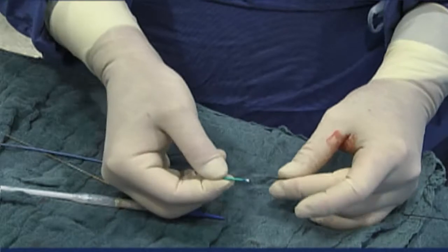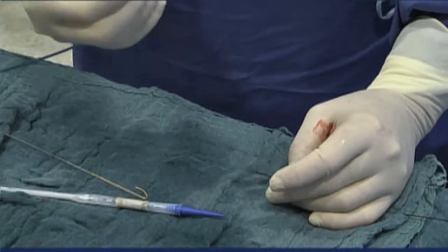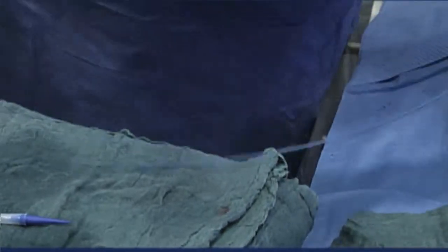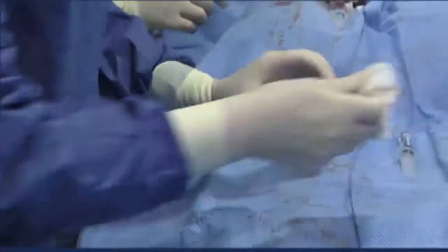and you may end up with everything falling into the right ventricle. The trick we use now is we take a 6-French right coronary guiding sheath. So the guiding sheath that the coronary people use to implant stents, I will take this over the Thermo exchange wire.